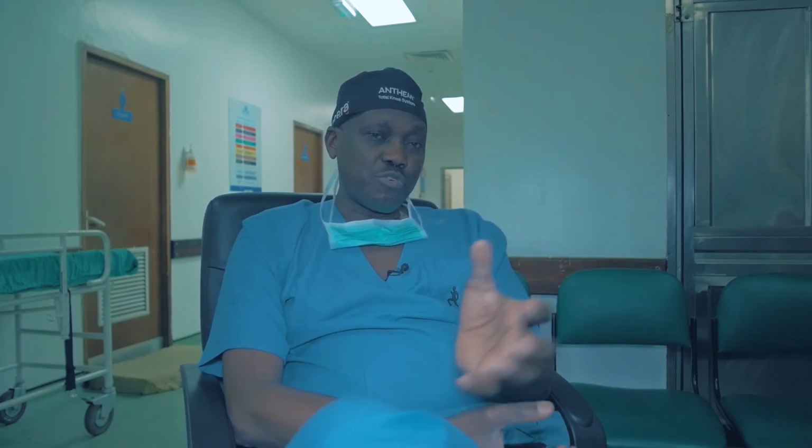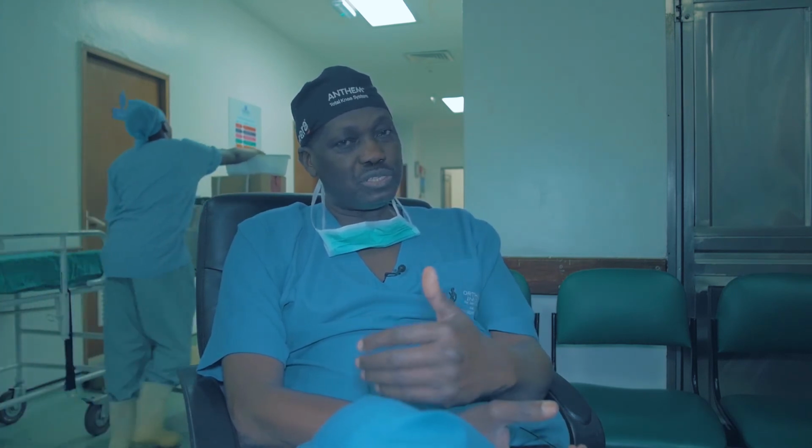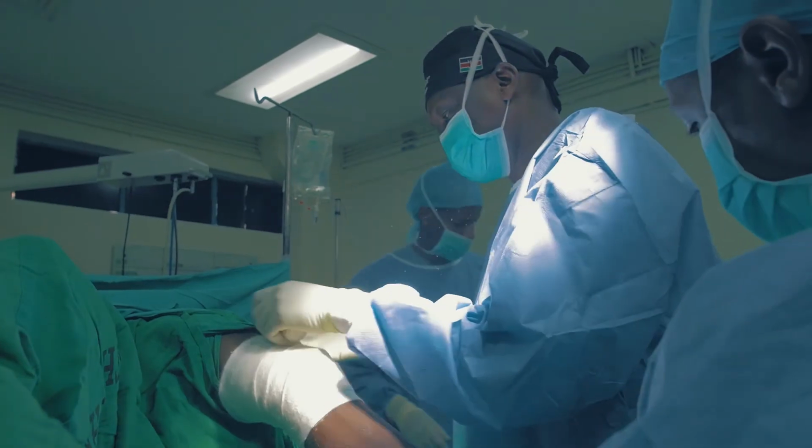We're able to concentrate quite a lot of platelets, and then we deposit the platelets exactly where we have created that defect by removing the cartilage that was there, and so allowing new cartilage to form. So we do hope in so doing this young man should be able to have coverage of that defect on the bone, and his pain should be able to go.